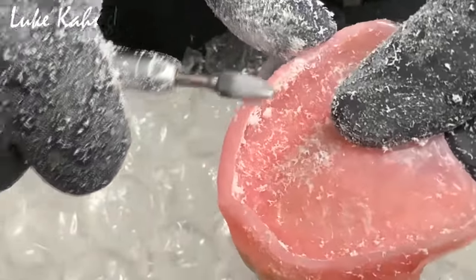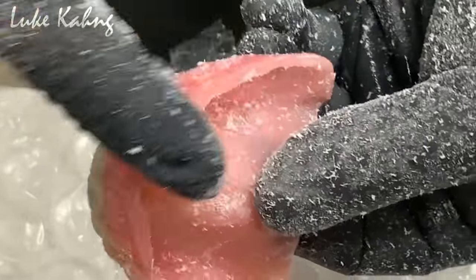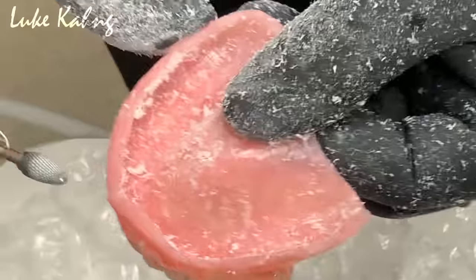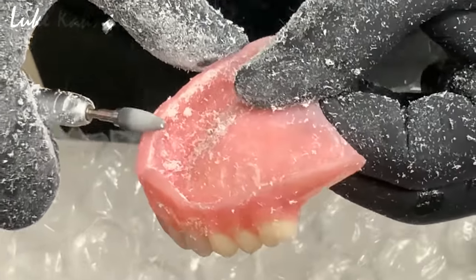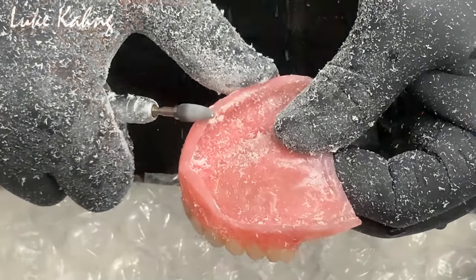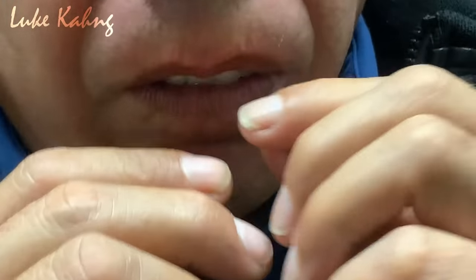And for those who may not know, the sulcus is the very top border. If you stick your finger in and you go all the way around the top, that's what you would adjust. Closer, less bulky. He's able to put it right in.